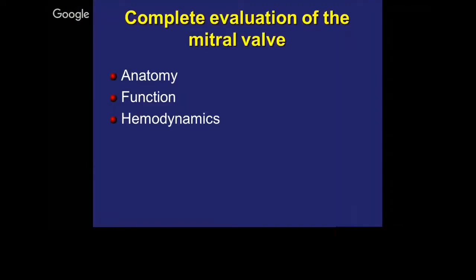The goal today is to talk about echo applications with a slant towards surgeons, and the usefulness and applications of basic echo and TEE for surgeons. So the mitral valve, surgeons are obviously more familiar with because they see it in real life.